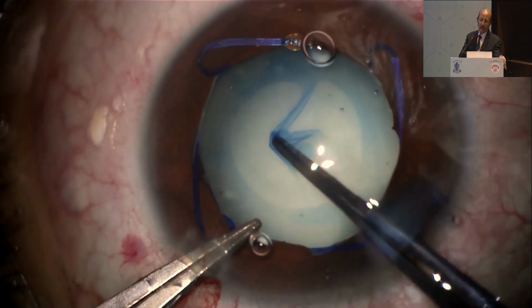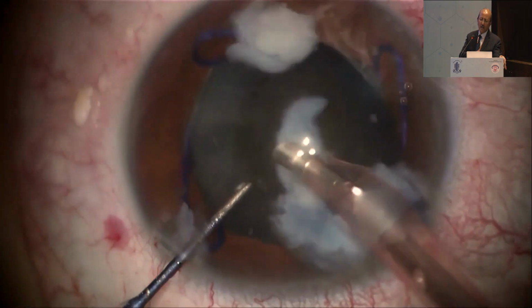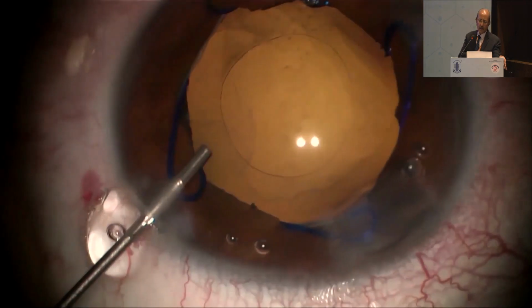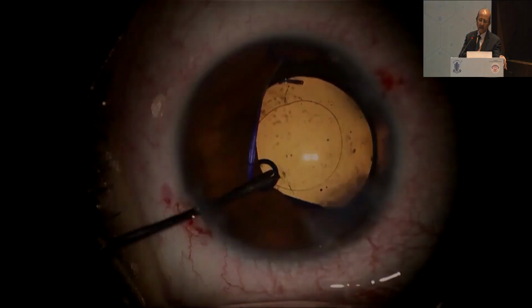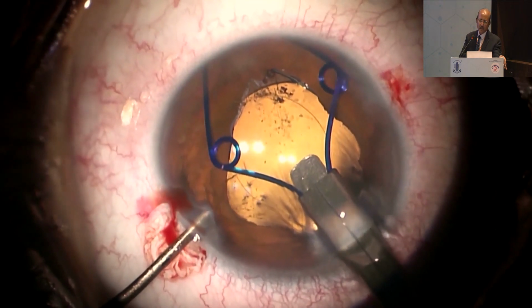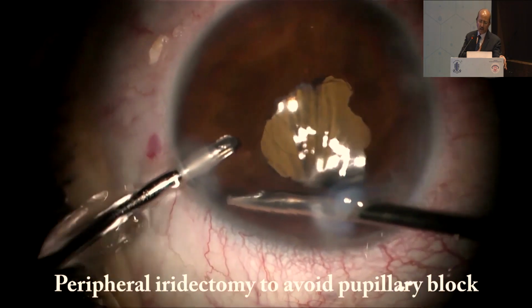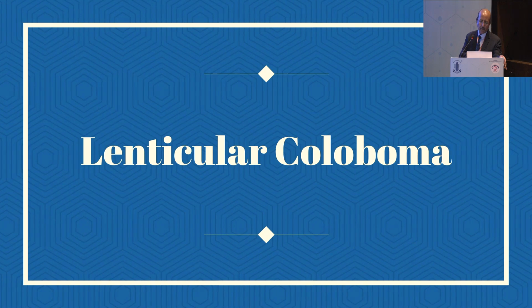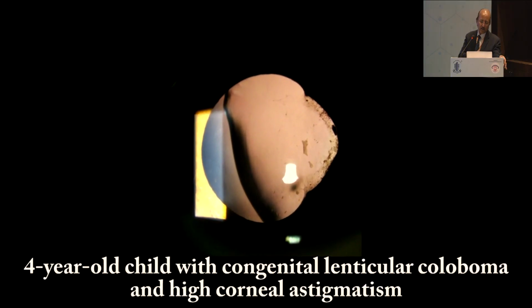Staining was done, and this is continuous curvilinear capsulorhexis. This is phacoaspiration. Actually you can do it with the IA also. And here is placement of the IOL in the capsular bag. And sometimes in such patients where there is 360-degree posterior synechiae, we do a small peripheral iridectomy. Not in every case.